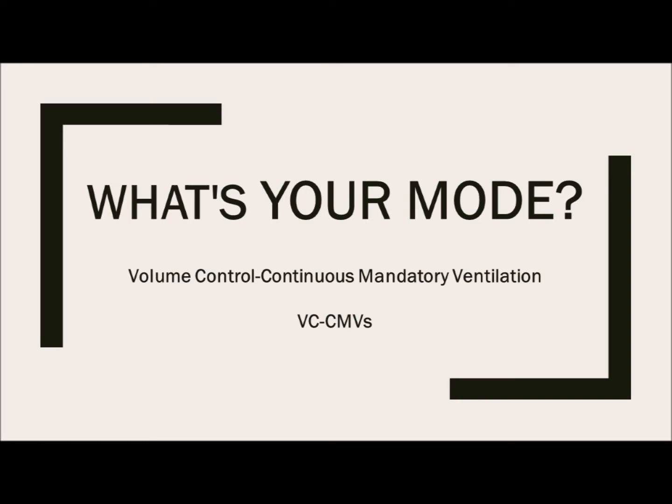Welcome to What's Your Mode? In What's Your Mode, I'll be discussing 18 different modes of mechanical ventilation and how they meet or don't meet the goals of mechanical ventilation. What's your mode? Volume control, CMV, set point targeting.